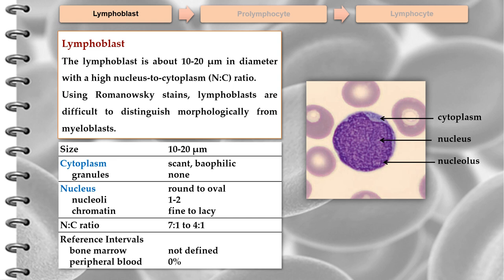The lymphoblast is about 10 to 20 micrometers in diameter with a high nucleus-to-cytoplasm ratio. Using Romanowski stains, lymphoblasts are difficult to distinguish morphologically from myeloblasts. The cytoplasm is slightly to moderately basophilic and without granules. The nucleus is round to oval, occupying about 80% of the cell. The nuclear chromatin is fine and 1 to 2 nucleoli are visible.